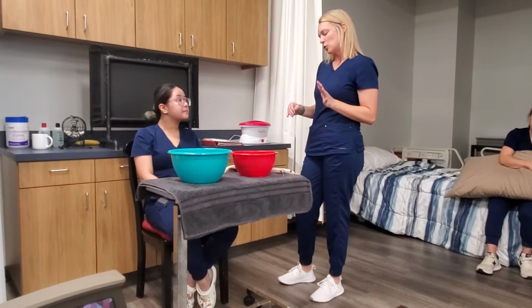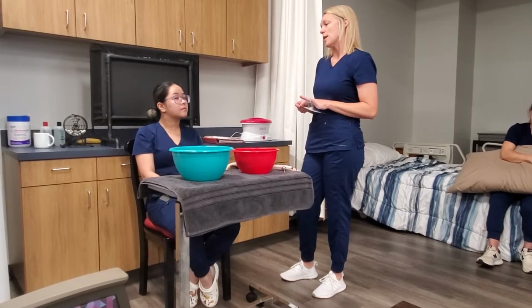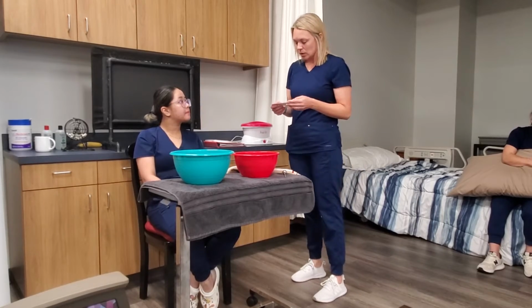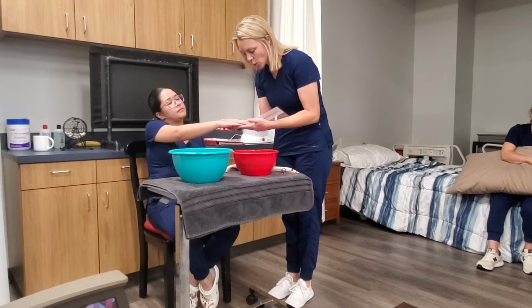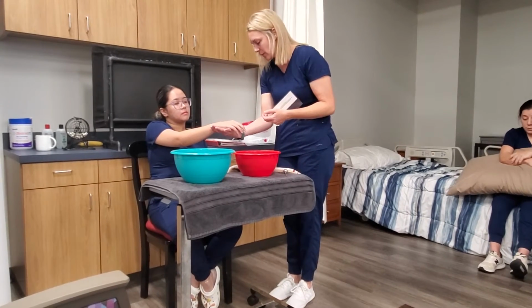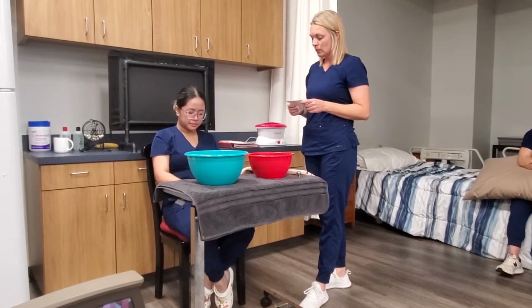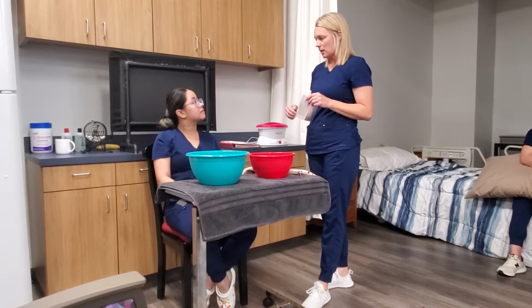Okay. I know that sounds a little weird, but before we start, I'm going to ask you some questions and make sure that it's safe for you to do this activity. Okay? So let me look at your wrist. I'm not seeing any open wounds. I don't see any infection, anything like that. I'm not even really seeing any swelling. Do you feel like it's swollen? Okay. All right. Has anyone ever put any pins or anything in any of your joints?